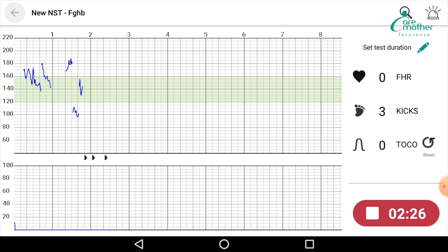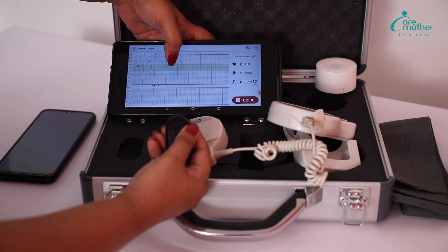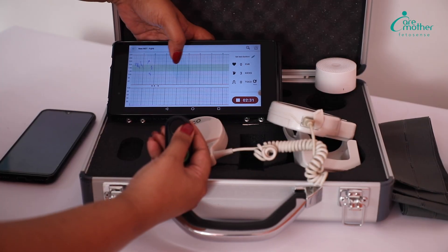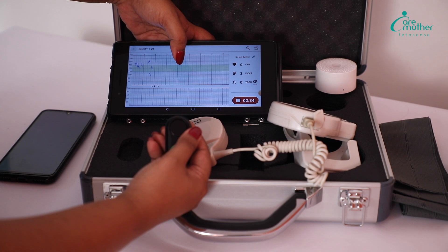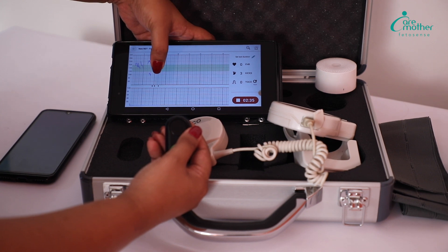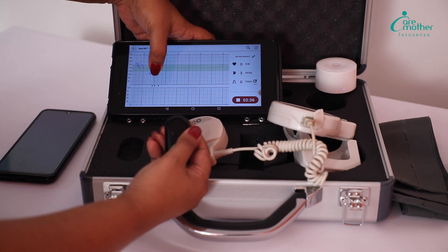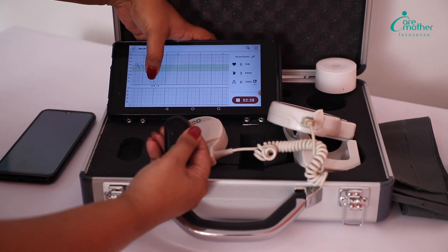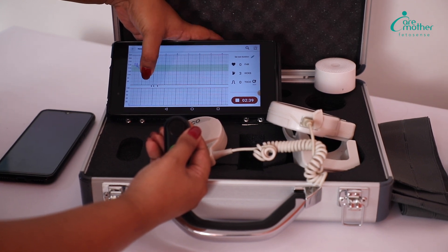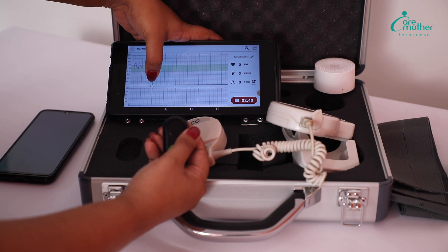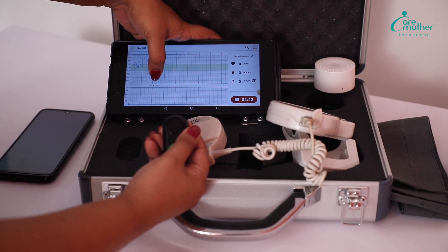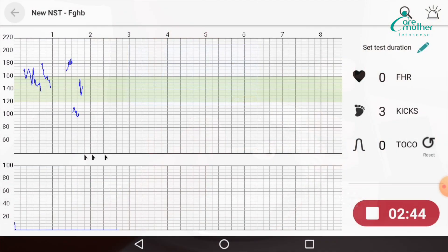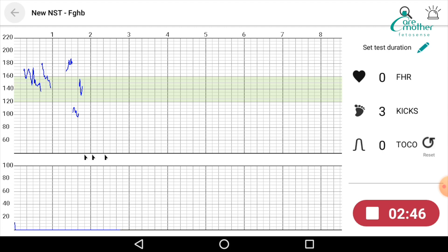In addition to the manual movement marker, this device is also capable of marking autofetal movements. When autofetal movements are detected, they will be marked in the line just above the manual movement lines with a double arrow sign.